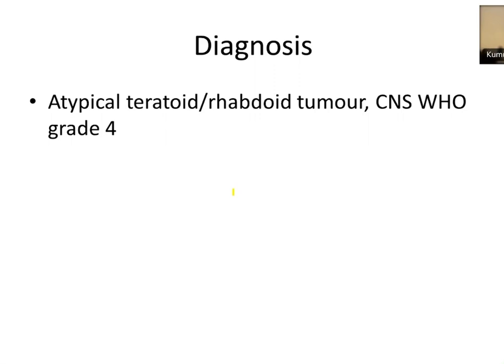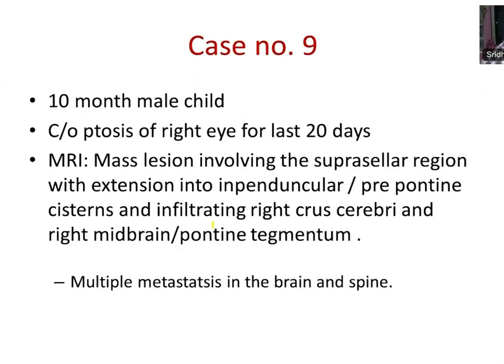So this is one of the specific subtypes of embryonal tumor where you don't require any molecular features. If you have a panel of INI1 and BRG1 IHC, you can diagnose this subset of tumor. No high-end molecular techniques are required to identify these tumors. Understood? Any questions, Pooja? We can go to the 9th case. Yes, sir, we can go. No questions. Yeah, 9th case, please.